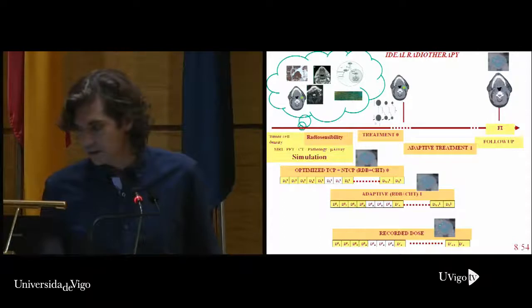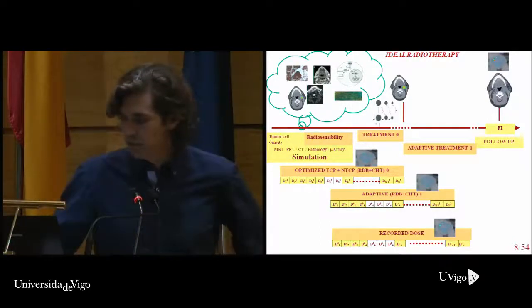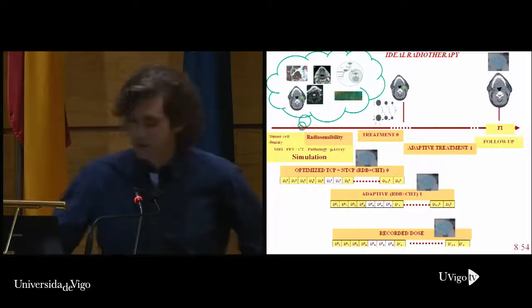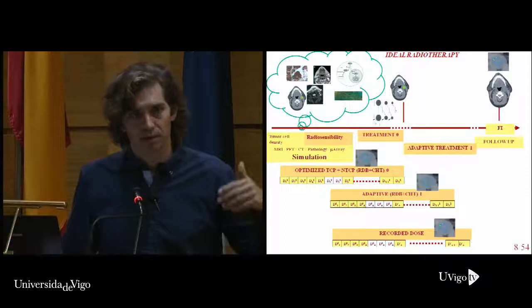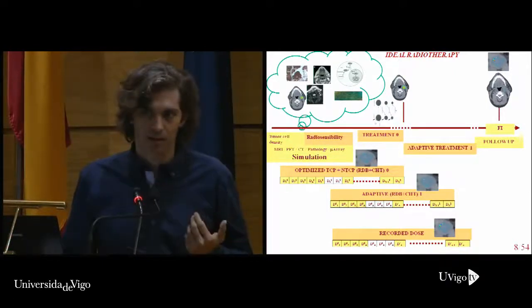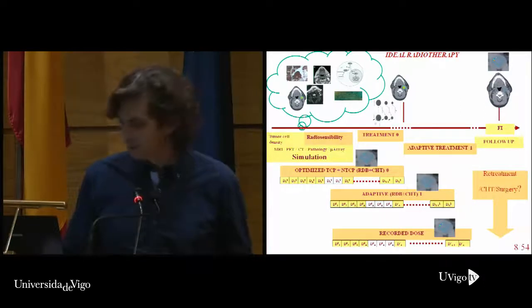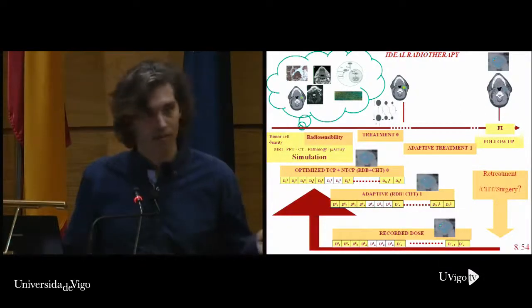And after that, we can make a follow-up image, again with functional imaging. And probably we have not delivered the amount of dose we are delivering now. Probably we can deliver less dose. Then the retreatment could be possible, if it's needed.